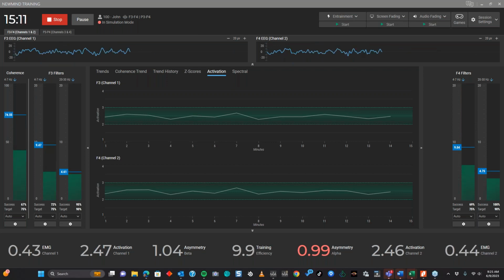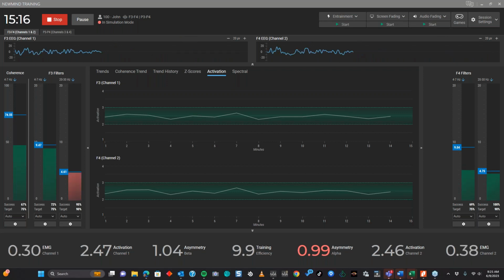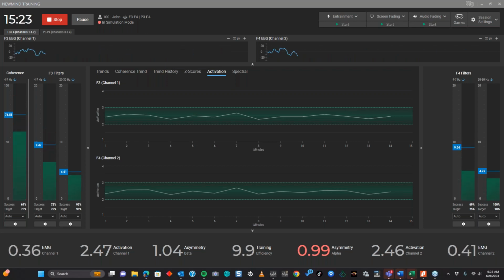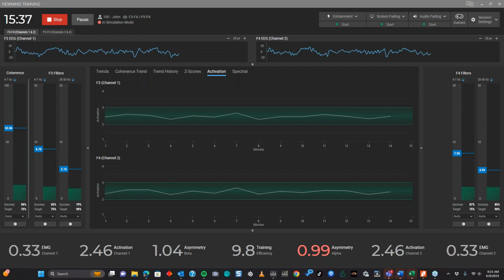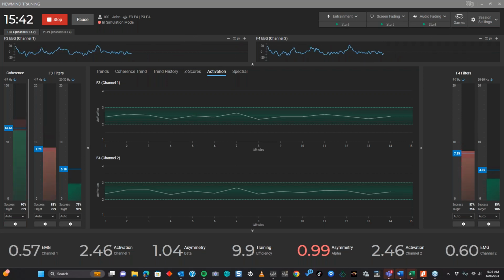I also want to comment on what you were talking about a while back, the emotional status and activation scores. It's one of the reasons we all harp on showing people educational materials. I went to help a clinic set up their equipment, and they were letting people pick what they wanted to watch on things like Netflix and their own streaming. Keep in mind that artifact affects your activation scores: sitting there watching a comedy and laughing is going to give you some definite artifact.